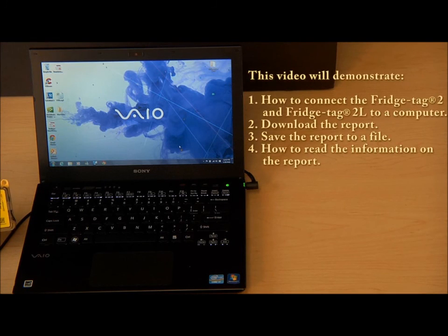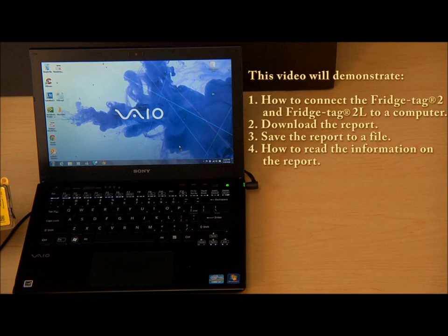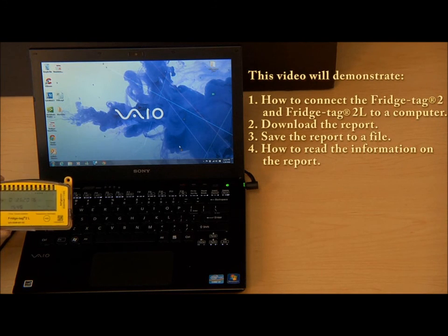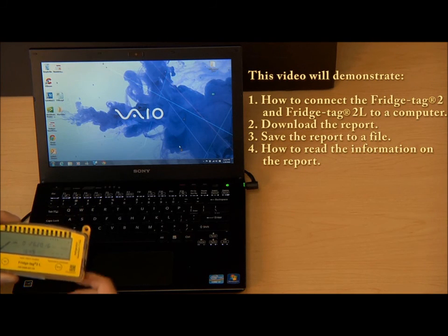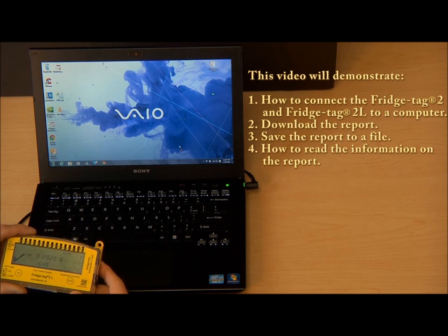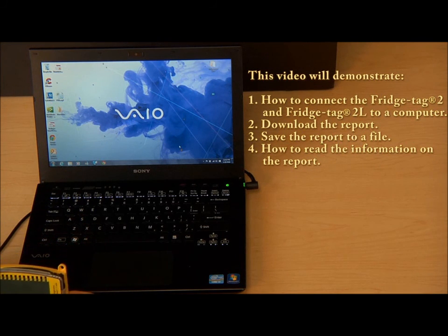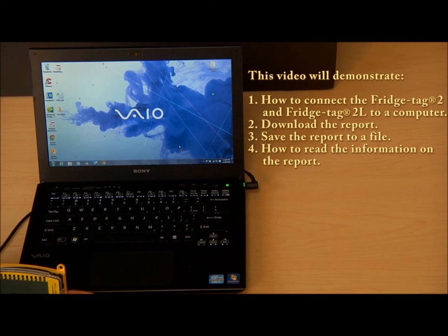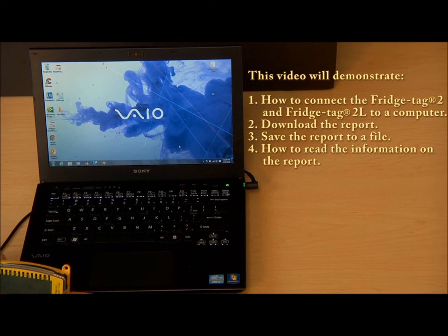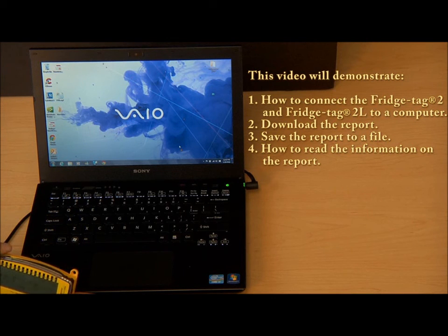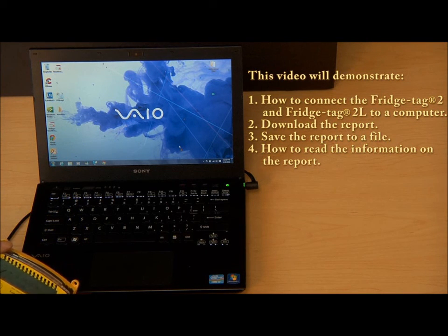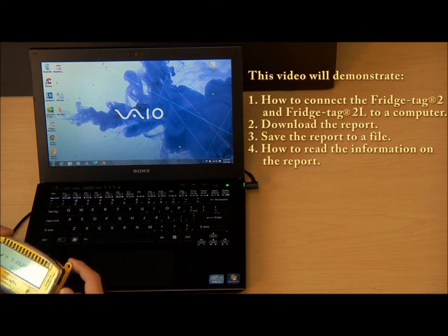In this video we will demonstrate how to connect the Fridgetag 2 and Fridgetag 2L to a Mac or PC, download the report, save the report to a file, and read the information on the report.